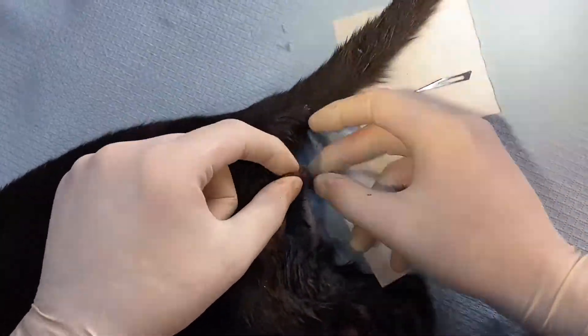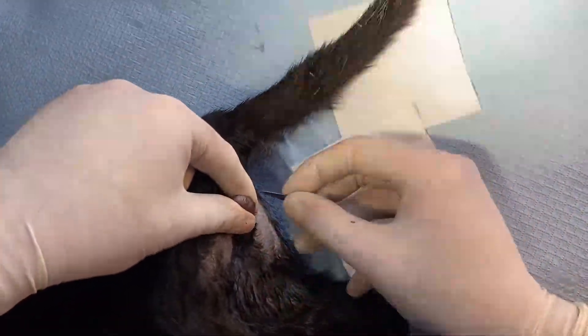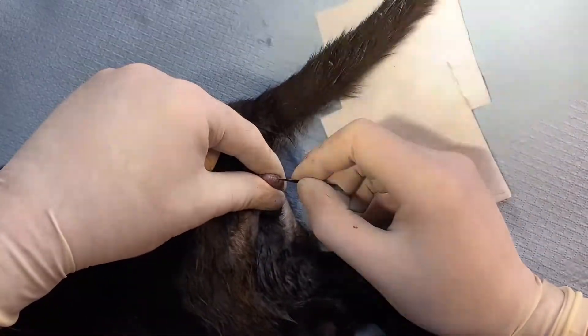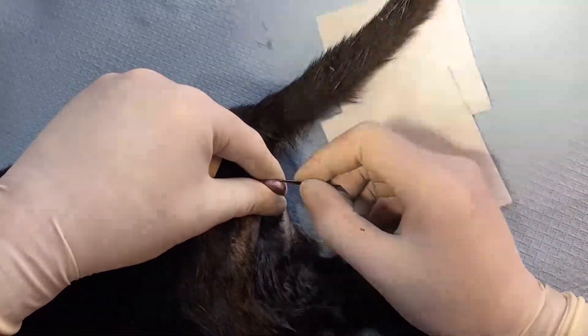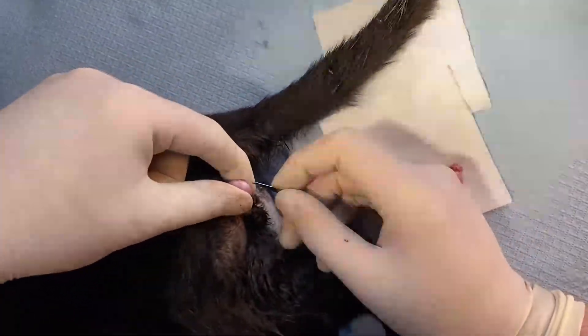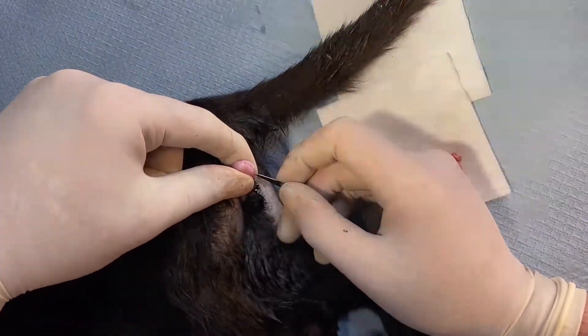Same with the other testicle — with a bit of squeeze, just run the blade over the skin until the testicle pops out like that. Then we just go through the underside here, not the attachment side — there's a bit of tunic.